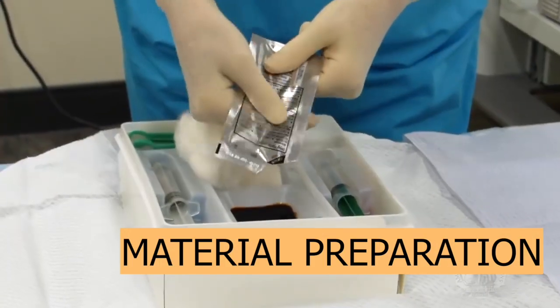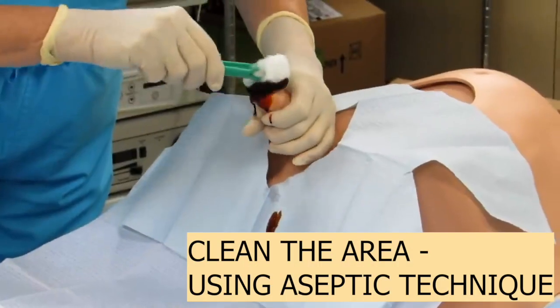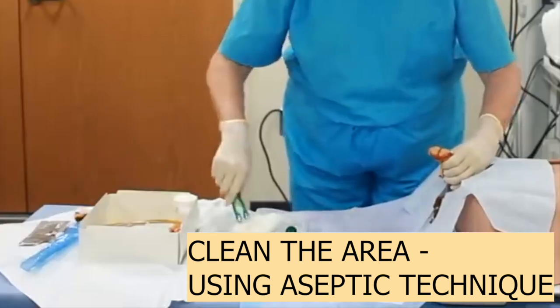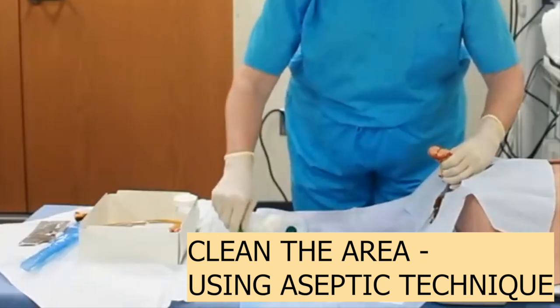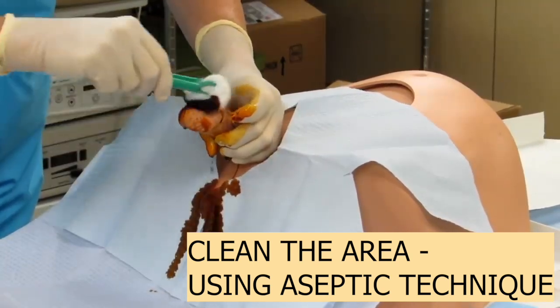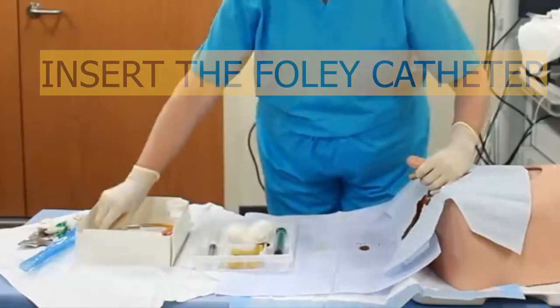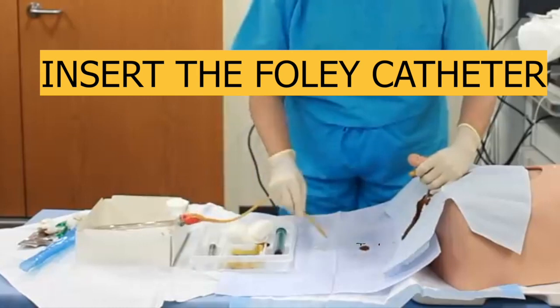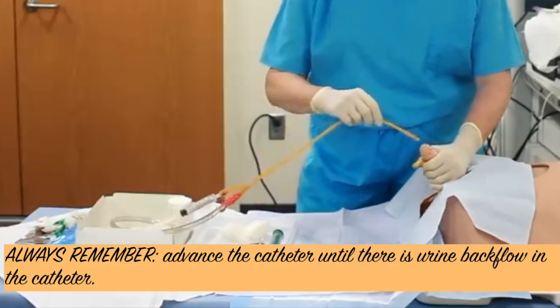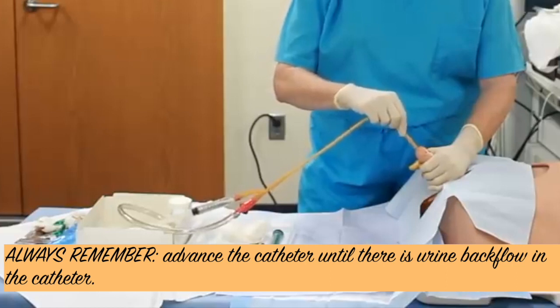We are also going to insert a foley catheter into male patients. Clean the glans penis using circular motion from the tip outward to the base of the penis, using cotton and betadine. Remember to use circular motion when cleaning. Once done, lubricate the foley catheter and insert it at a 90-degree angle — using 90 degrees is important for male patients.